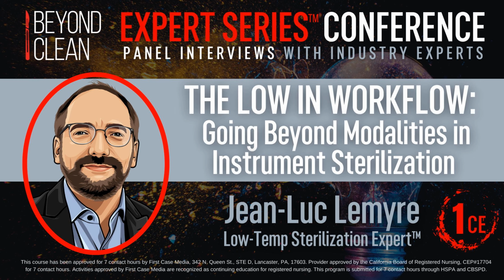A few other differences, obviously the temperature, and it impacts how it can be used. Your low temp sterilizer, as the name implies, is at a much lower temperature. Typically it's 40 to 55 Celsius, which would be 100 to 130 Fahrenheit. So that allows processing of heat-sensitive devices. That's actually one of the main reasons to use a low temp sterilizer. Anything that would get destroyed in steam can be processed there. As soon as the device comes out, it can be used. It's patient ready. In steam, you need a cool down period. Some other differences are really practical, like chamber size, the way the load is configured, and type of packaging used. You mentioned cellulosic material, paper, before, which can be used in steam but not in peroxide.